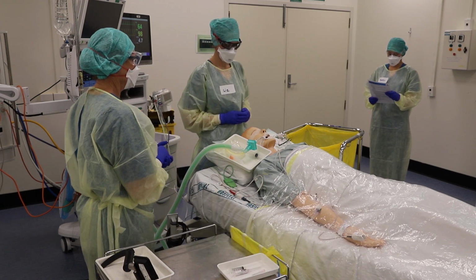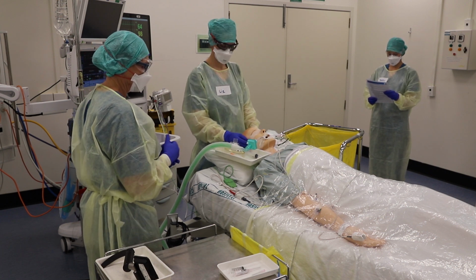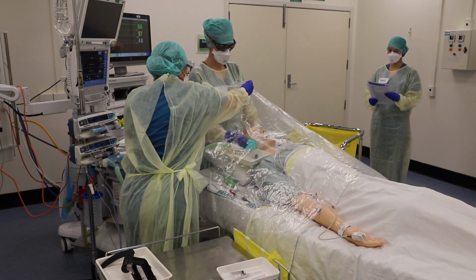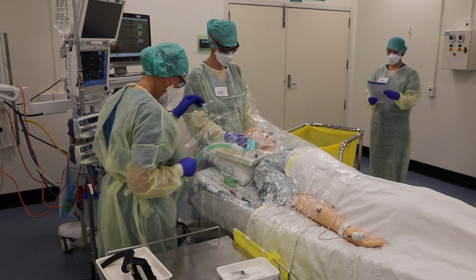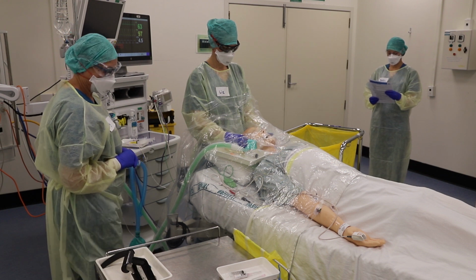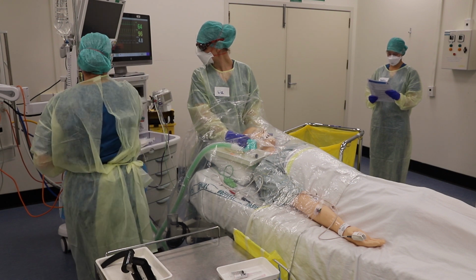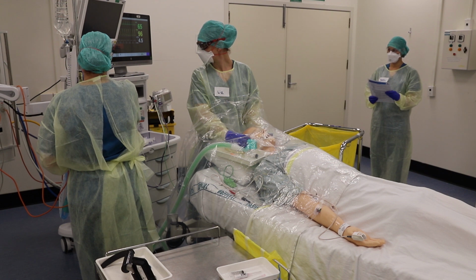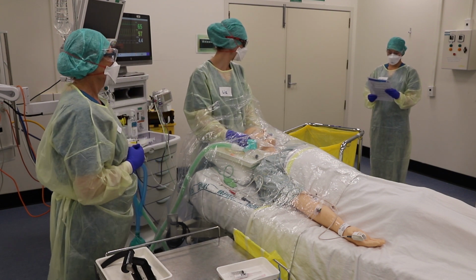Tech draws plastic sheet over patient's chest and head, covering anaesthetist's forearms. When ready, anaesthetist instructs tech to turn off anaesthetic. Could you turn off the SIVO now, please, Kay, and just turn the oxygen up to 10 litres at 100%. That's confirmed. Thank you. That's done.